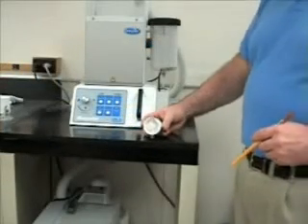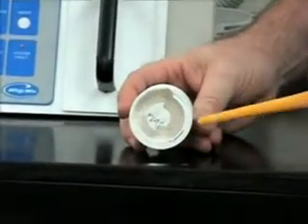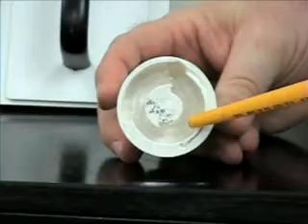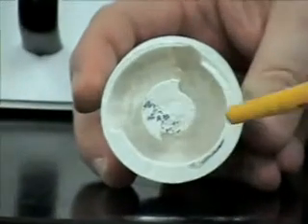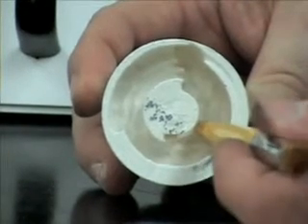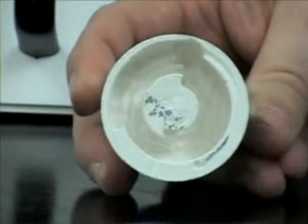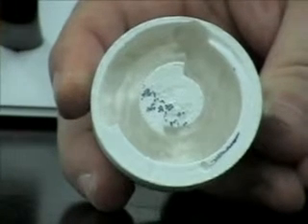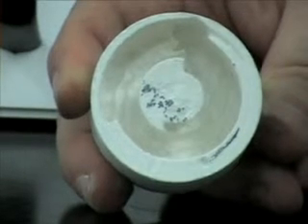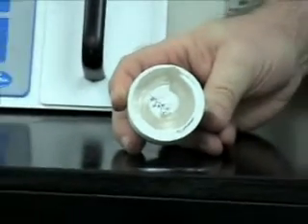I have a partially divested ring here. The cycle was aborted at this point here, but I just want to illustrate for troubleshooting depth of cut. You'll notice that there is no skipping or any other type of artifacting that would suggest that the bead flow was intermittent. However, the depth of cut into the interior of the investment mold is not as deep as desired. So there's two solutions for this situation. The first one, of course, is to increase the setting on the knob on the front panel of the unit. Going clockwise will increase the depth of cut.